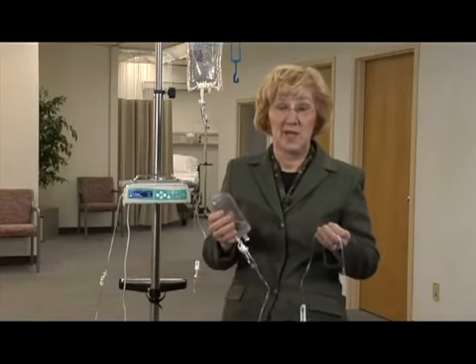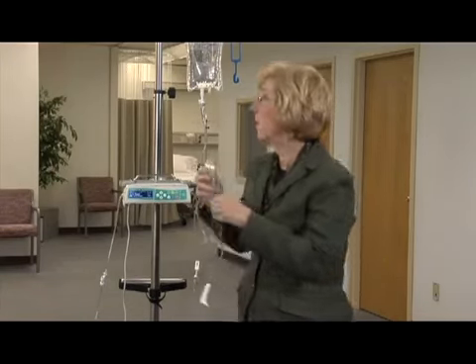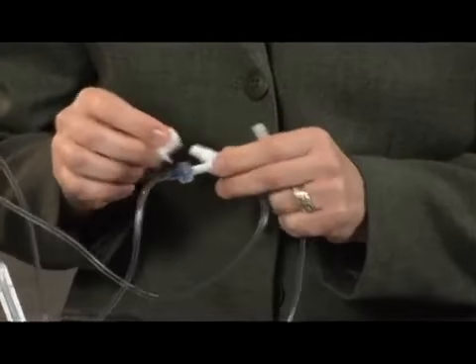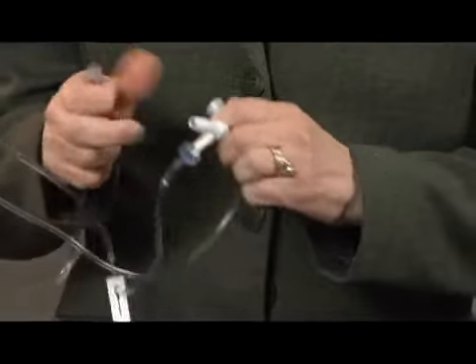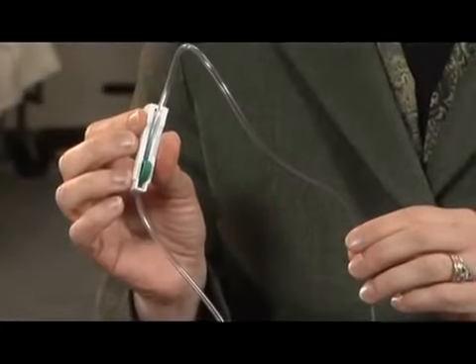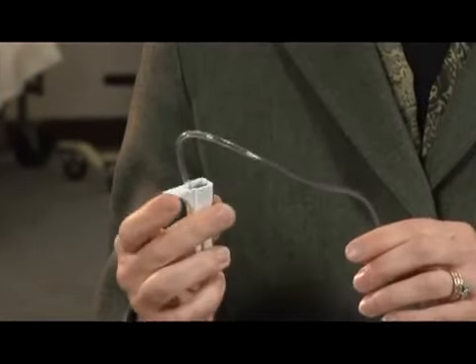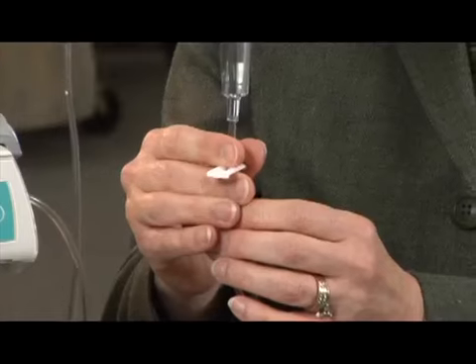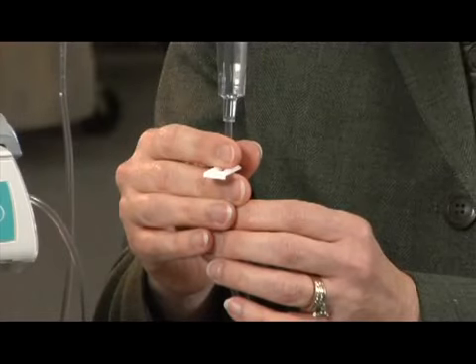Now let's prepare a piggyback infusion by following these steps to hang the infusion. I've already spiked and manually primed my piggyback set. Hang the piggyback at least eight inches above the primary bag. Swab the upper injection site on the primary set and insert the piggyback set into the primary set injection site above the pump. Open the roller clamp on the piggyback IV set. If the piggyback infusion rate will be greater than 300 mils per hour, it is recommended to close the primary line slide clamp directly above the upper injection site to prevent sympathetic flow.